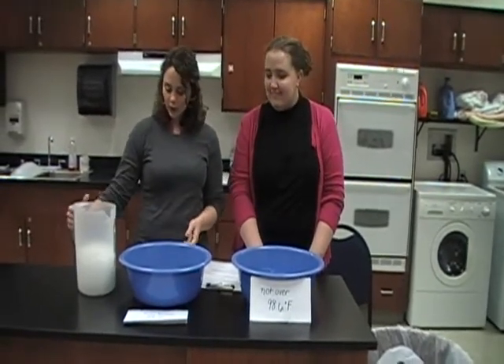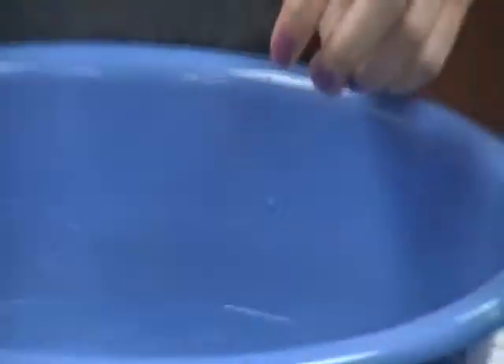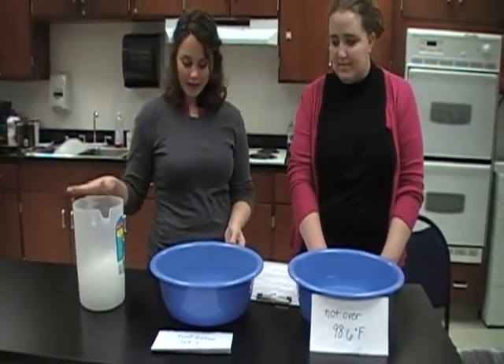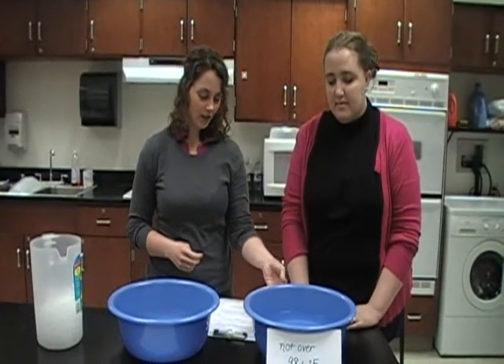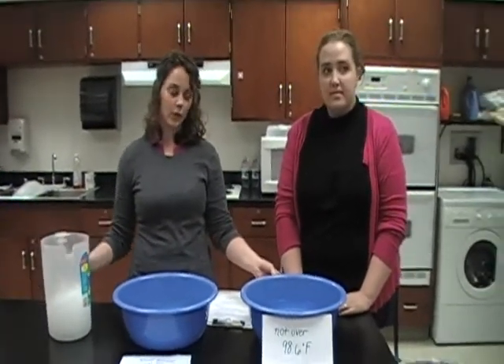To make the cold water cold, you add ice to it. We would usually have a thermometer to measure the water, but we don't have one. You add ice until the water is 59 degrees, and then you add hot water until you make it just right at 98 degrees. If it's too hot, you add a little bit of ice or cold water to it.